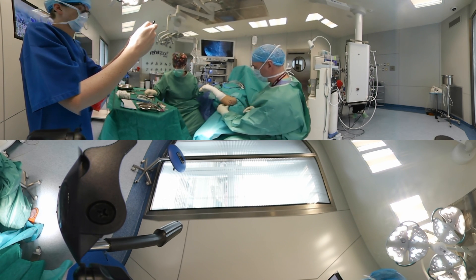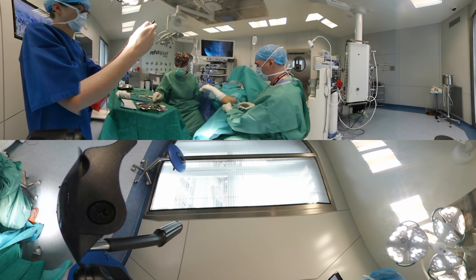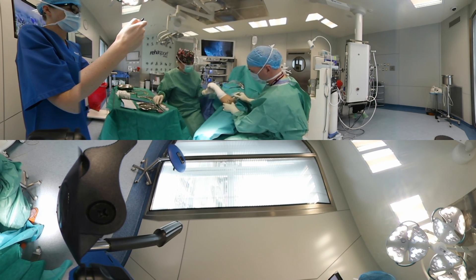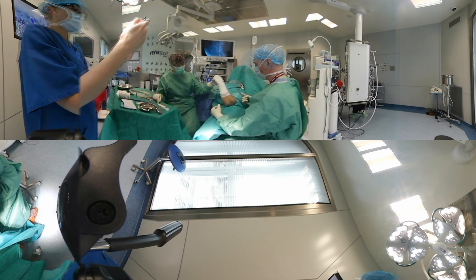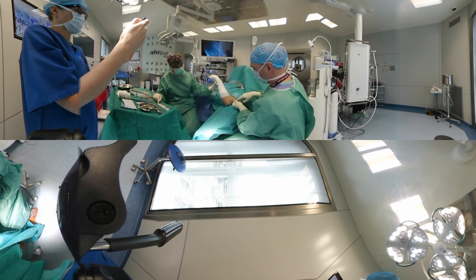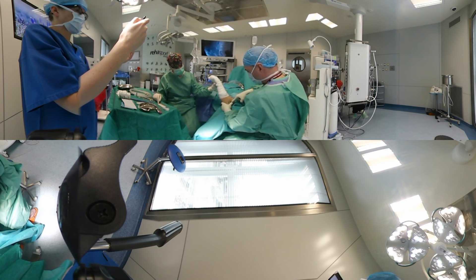The elbow joint is injected with 10 ml saline to expand the capsule. Skin is incised at the mid-lateral portal. The elbow is positioned in 90 degrees flexion and the forearm fully pronated. The probe is introduced sliding on the anterior surface of the distal humerus through the capsule.